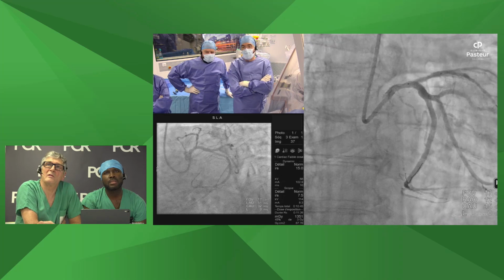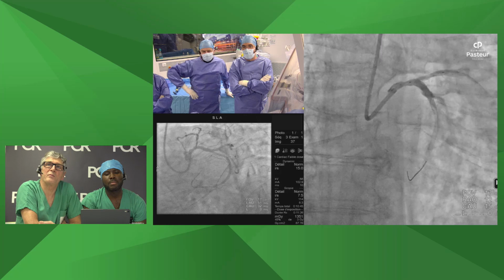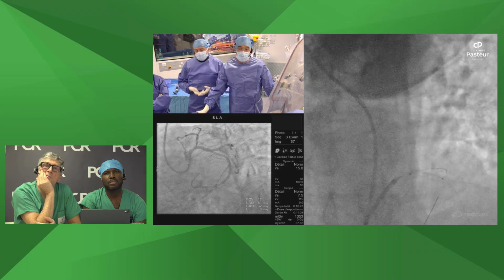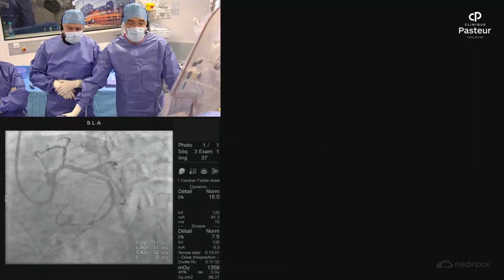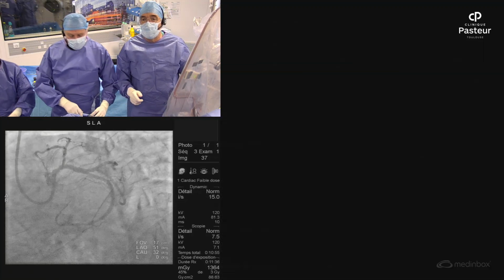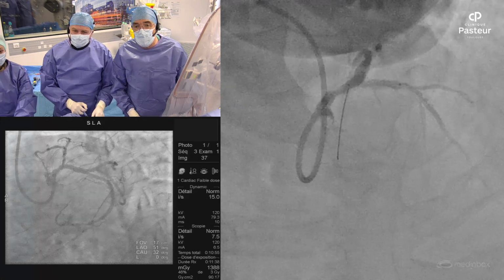I would say it's difficult because we don't see exactly what length we need between the ostium of the left main and the distal left main. I think 38 should be, in terms of length, the most simple. But if we use a 38, we may touch the second lesion of the middle LAD. Exactly. 33 could be good to avoid touching the middle LAD, but could be short for the left main. So that's the difficulty, to see in this view the ostium of the left main.